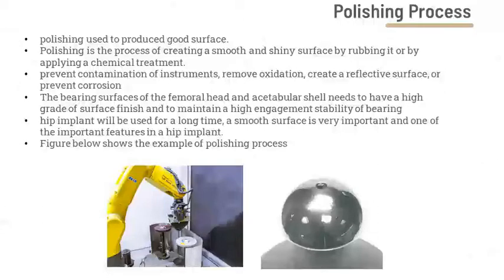Hip implant will be used for a long time. A smooth surface is one of the important features in hip implant. The figure below shows an example of the polishing process.